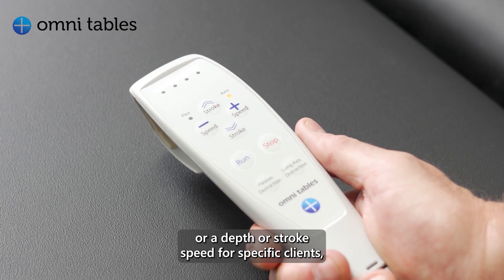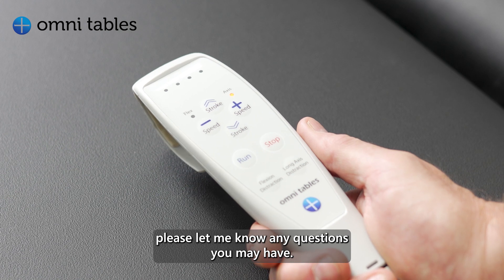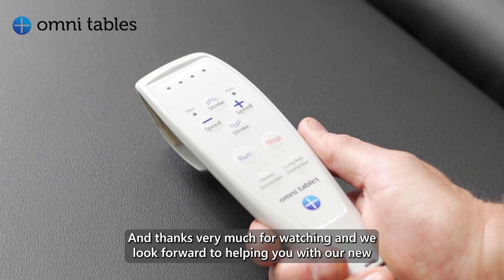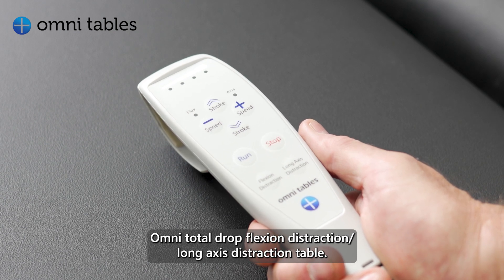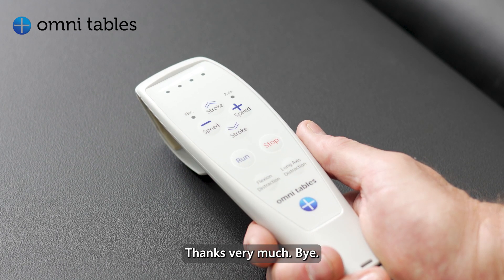So it makes it easy if you have a preferred technique, depth, or stroke speed for specific clients. Please let me know any questions you may have — thanks very much for watching, and we look forward to helping you with our new Omni Total Drop Flexion Distraction Long Axis Distraction table. Thanks very much, bye.